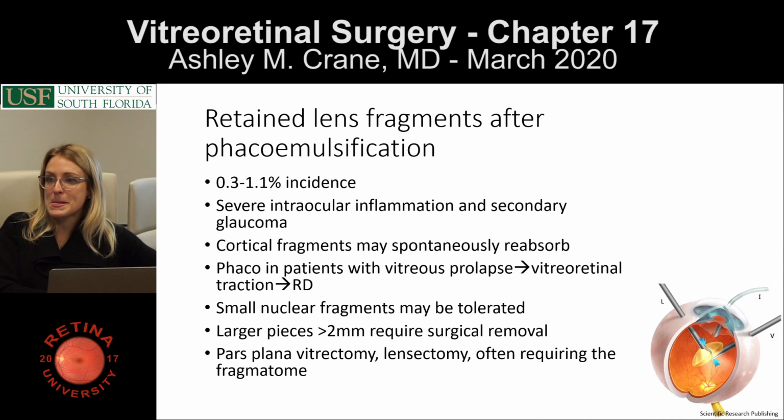I have a question. What's the benefit of inserting the IOL? Well, the next person would have to do it, right? I think oftentimes the anterior segment surgeons are more used to putting in IOLs. The capsular bag may be easier to see. Say you've stained it, or you know where it is, you know where your rent was. We're not going to know where your rent was if there's an anterior rent. And actually, a practical thing, a lot of places I do surgery don't have IOLs.